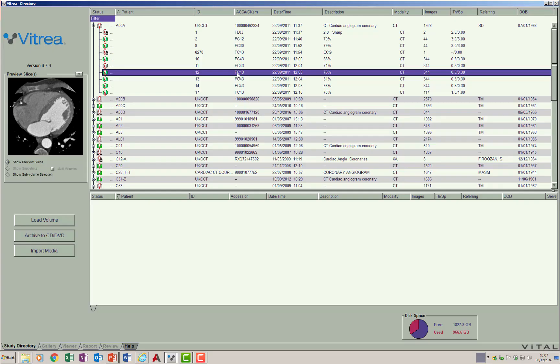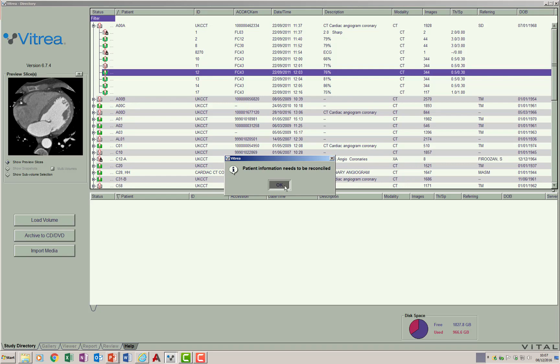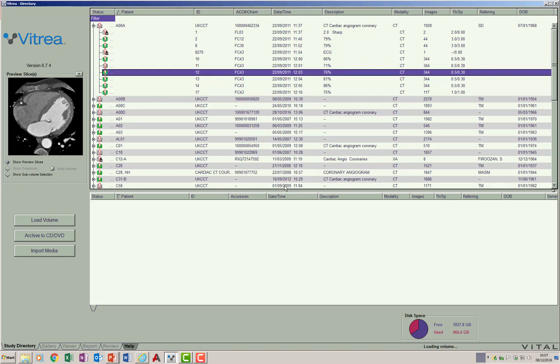We have different studies in this directory of a software called Vitrea, made by a company called Vital Images. I'm choosing one of the series from a patient labeled as A-zero-zero and loading this series in the software.